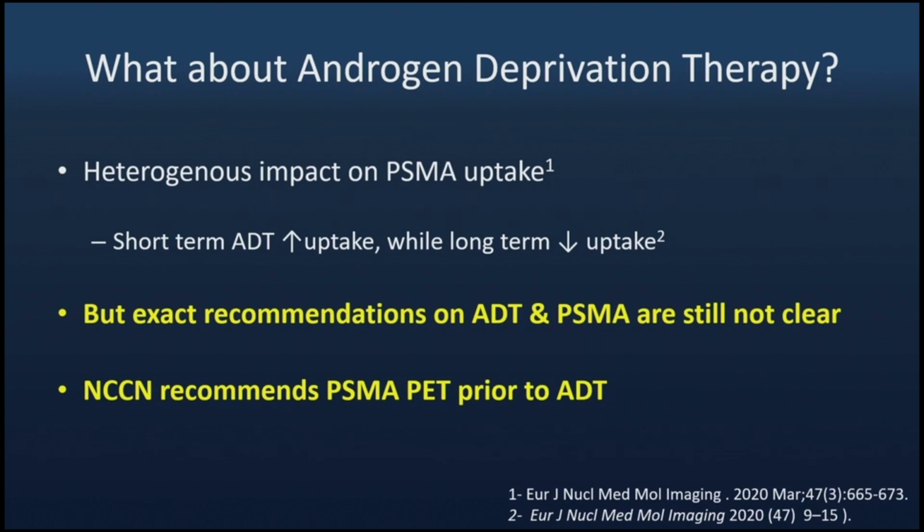We've had a few patients where we had a backlog of our PSMA PETs. They get their ADT first. I'm staring at it going, oh no. Is this a negative scan or is this just a patient who's started getting response?